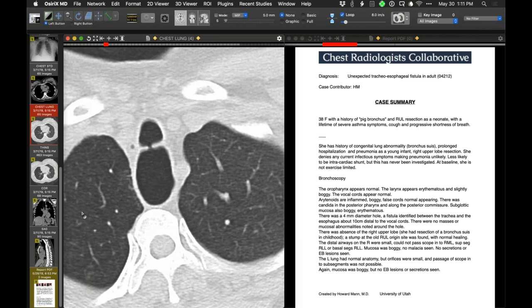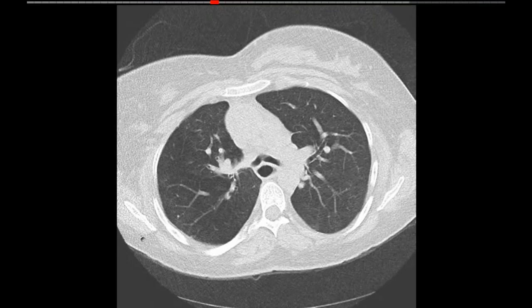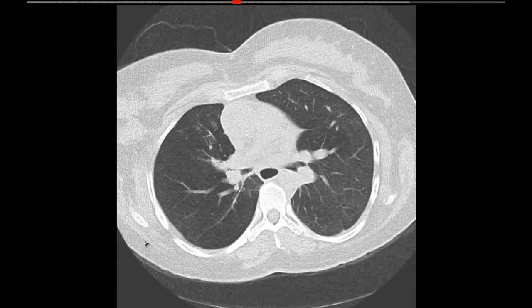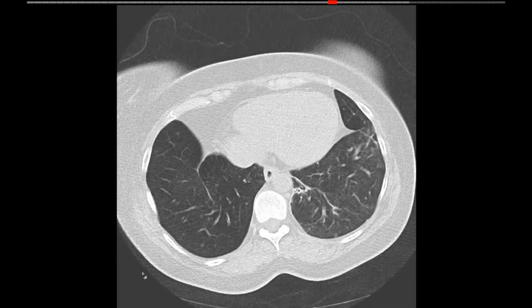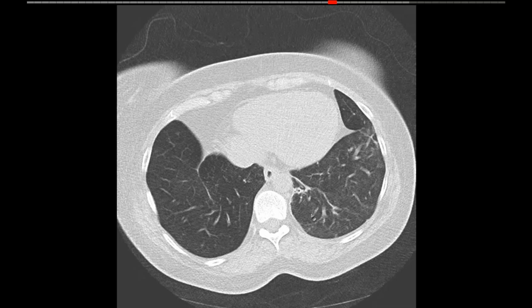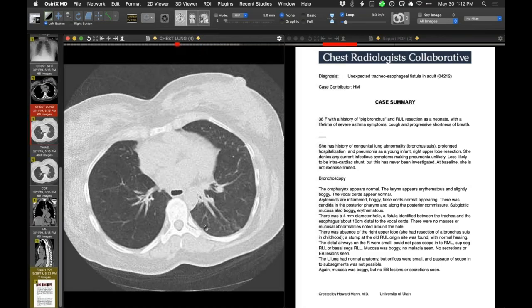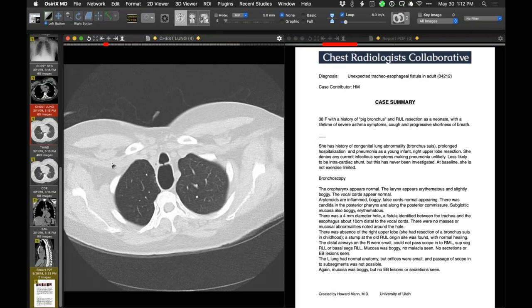We see patients that have had a TE fistula repair that end up with abnormally distended esophagus and dysmotility - the esophageal disorder is part of the congenital TE fistula. I don't know why her lungs look this way. Maybe the right lung just looks the way it does because one lobe is gone. There may be some mild bronchial disease from repeated episodes of aspiration - it's a good aspiration distribution, particularly on the left. But relatively modest findings. I thought it was going to be achalasia - but maybe it's both: esophageal motility disorder and a TE fistula she's lived with.